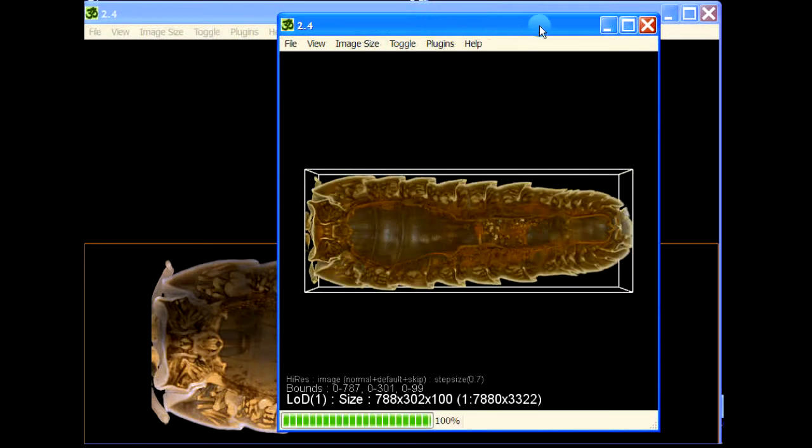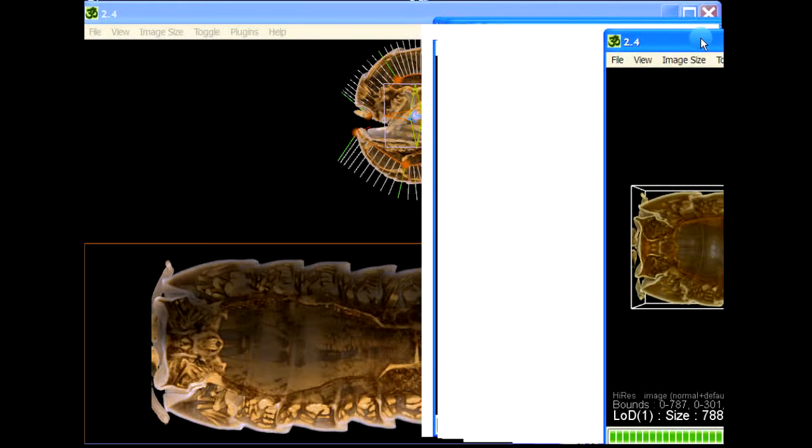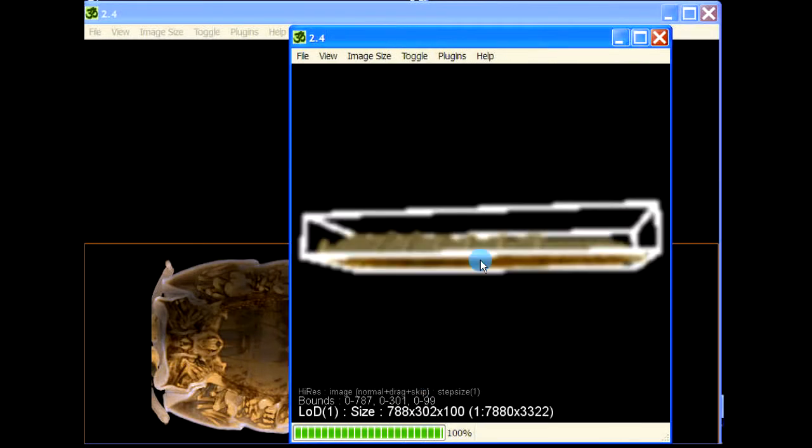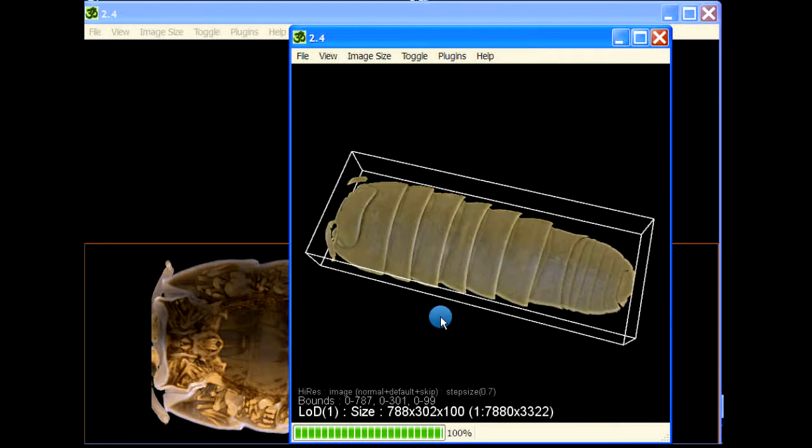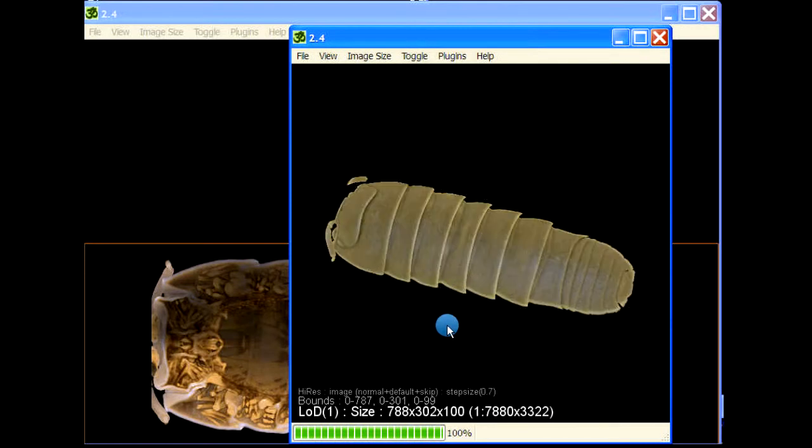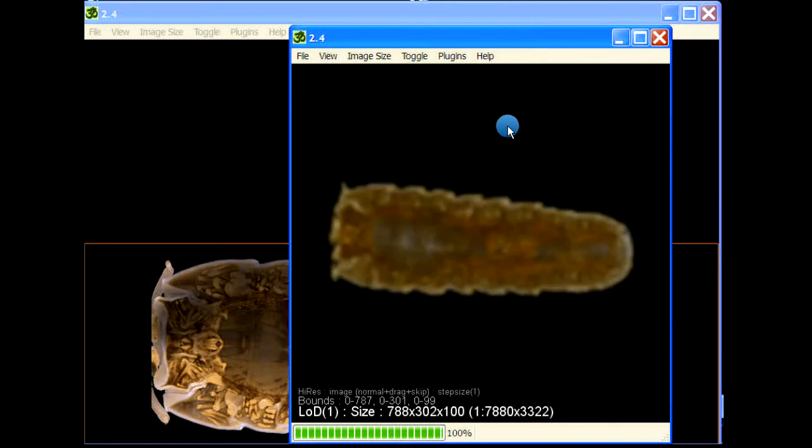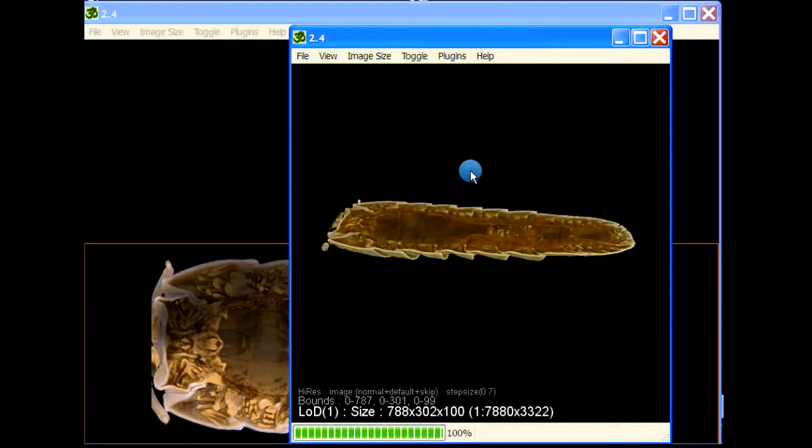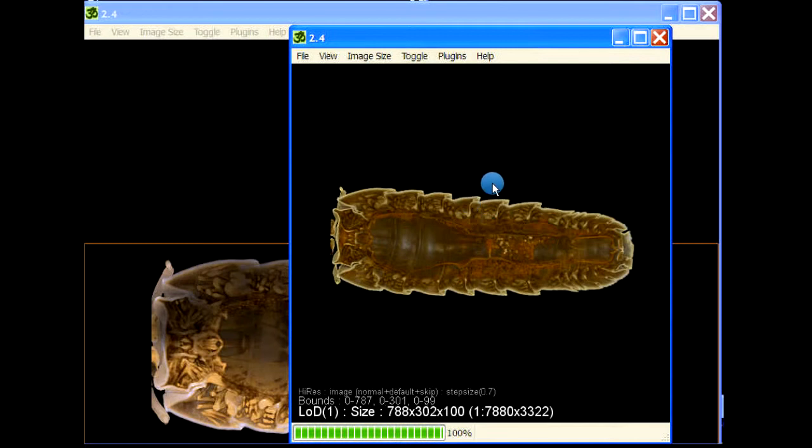Like the clipping plane, we also can use reslice to save the data or the volume or the part of the volume that we see in the viewport. Now this you can use to straighten anatomical data, medical data, or even rock datasets. For example, if you want to see the data from all the sides at the same time, you can put a path around your data, say rock or whatever, and then you can straighten it out.